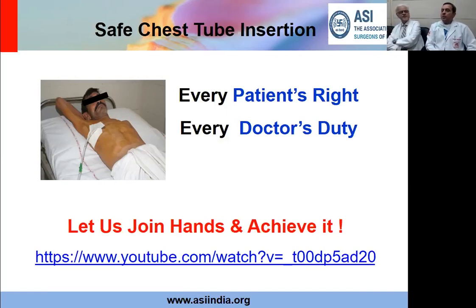So, here also, prevention of tube blockage is the best option. So why does the tube get blocked? The tube gets blocked because there may be blood, and usually it gets blocked when it gets kinked. So the column is there and the blood clots inside. If the blood is draining freely, it will not get blocked. But sometimes there could be kinking and that blood column remains inside and that gets blocked.